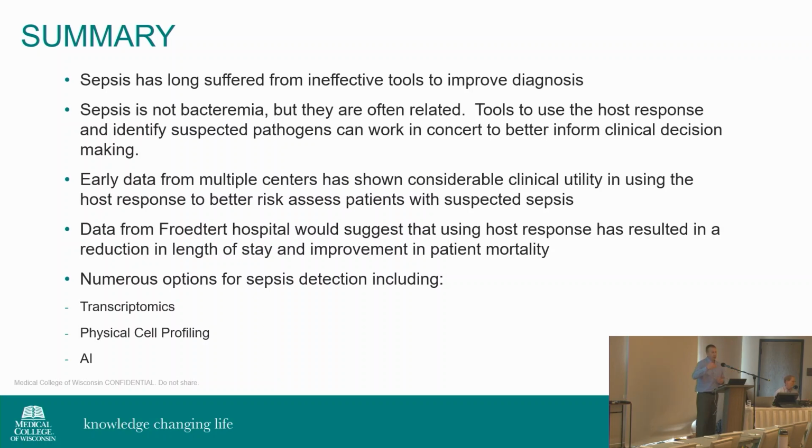So we've been allowing this to be somewhat of an ED physician determination, whether they want to use it or whether they don't want to use it. If we look at that in the context of our broader sepsis population, we're seeing it used in about a third to half of the population it should be used in. So we've actually got a pilot right now that we're about a month into, where anytime somebody orders a lactate, you're going to get this IntelliSep result, because we're still in the pilot phase right now and there's no cost implication to that.